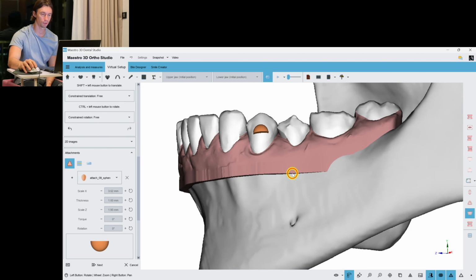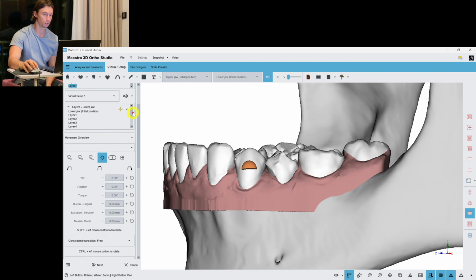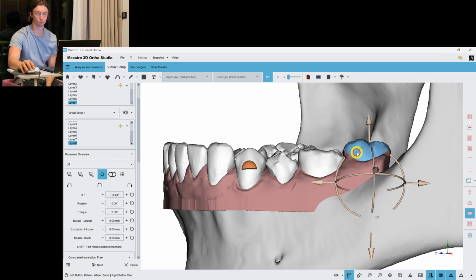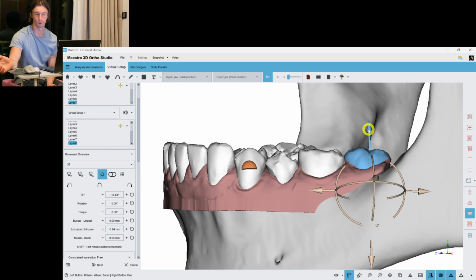Yeah, by the way, this is what we always get when we distalize the lower teeth. We'll always do it with tipping. We cannot intrude it because we just don't have enough anchorage. So how can we intrude with just a tip of an aligner? It's not possible, we don't have enough force.